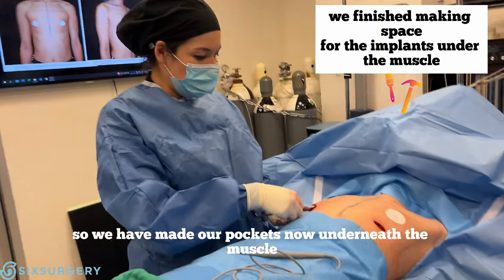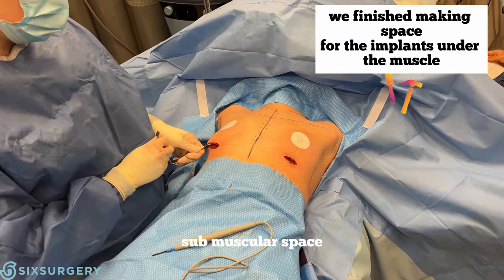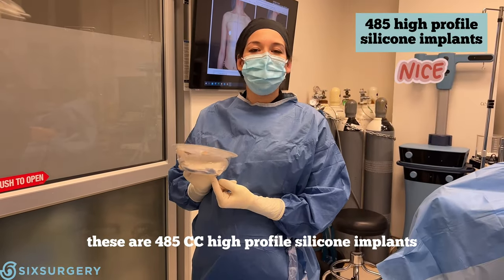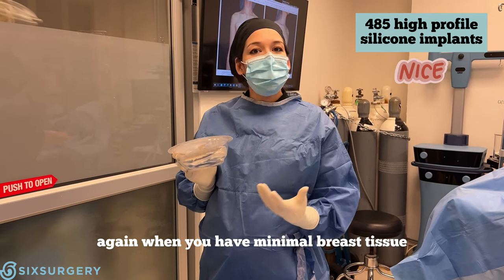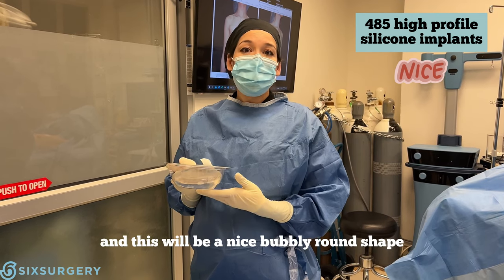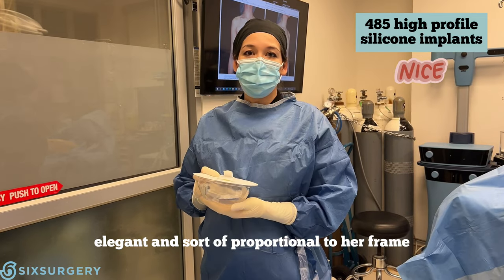We have made our pockets now underneath the muscle — our sub-muscular space — and we're all ready for the implants to go in. These are 485cc high-profile silicone implants. When you have minimal breast tissue, the silicone is going to give you the most natural feel, and this will be a nice bubbly round shape, but still very elegant and proportional to her frame.